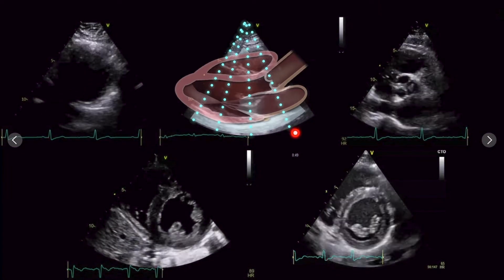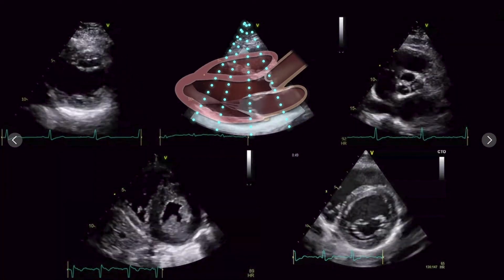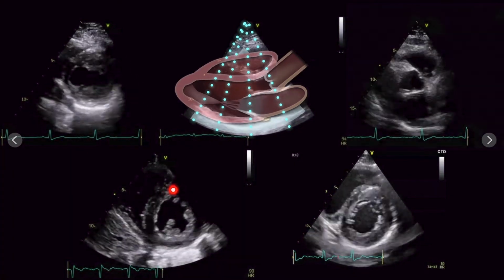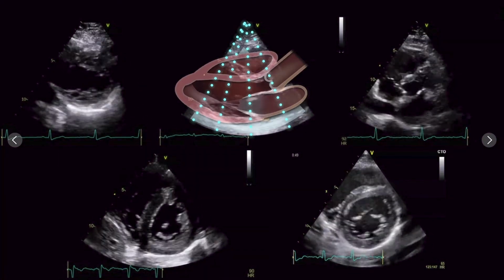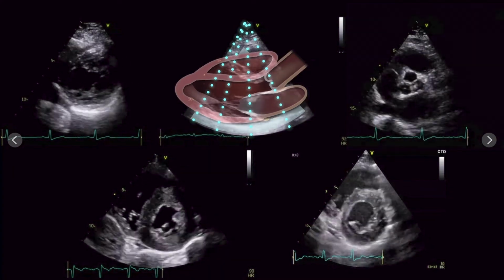So this is the level of the aortic valve, the level of the mitral valve. Here you see the aortic valve, here the mitral valve level. The level of the papillary muscles, here you can see an example where the papillary muscles are thickened and left ventricular myocardium is also thickened. And we continue even to the apical regions.